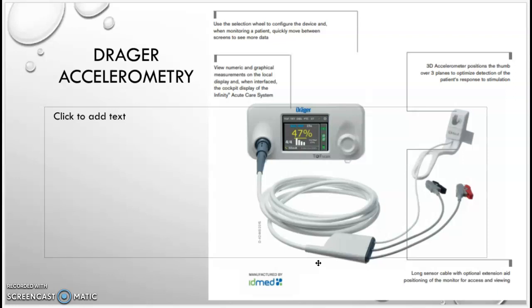that, Ratan, we are doing a case together. The patient is pretty sick. The patient has myasthenia. The patient is frail. And the case is pretty long. And also uncertain or complete paralysis. I don't know if I will be able to extubate the patient, but let's do quantitative neuromuscular monitoring. And I had no idea what he was talking about. I never saw a device that can do quantitative monitoring of the train of 4.